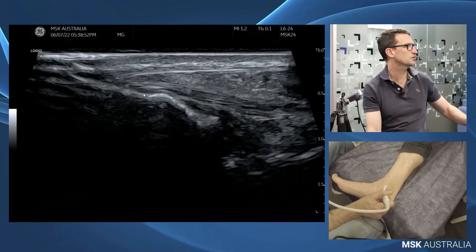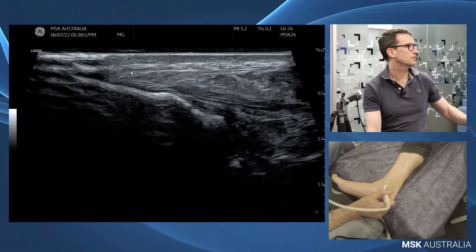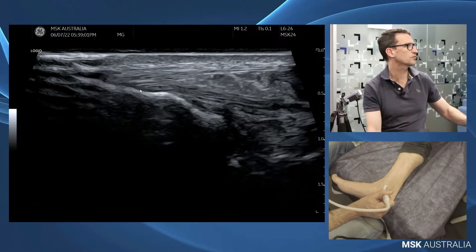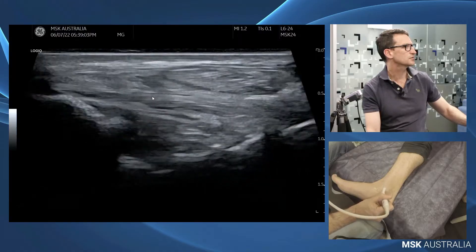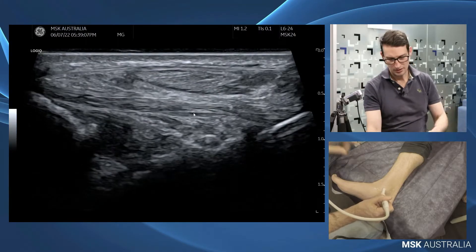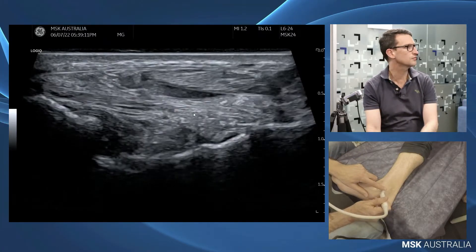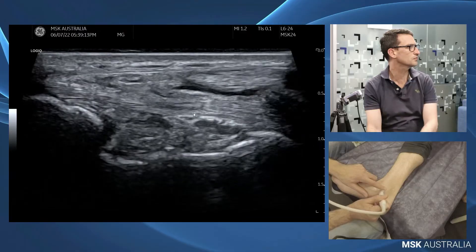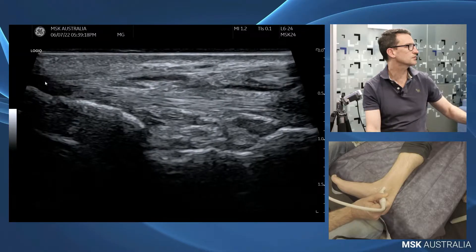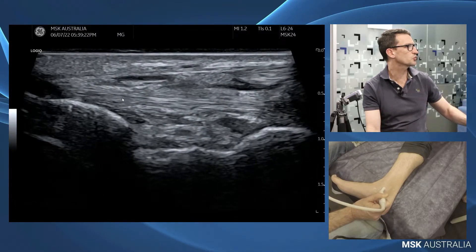This is where we can get issues with an eversion injury — we can tear the flexor and strip this flexor and deltoid ligament off the tibia. So that's our tibio-calcaneal. As we keep that toe end anchored and rotate a little further around, we come onto our tibio-spring ligament. So here's our flexor retinaculum, our tibia, and our tibio-spring ligament.